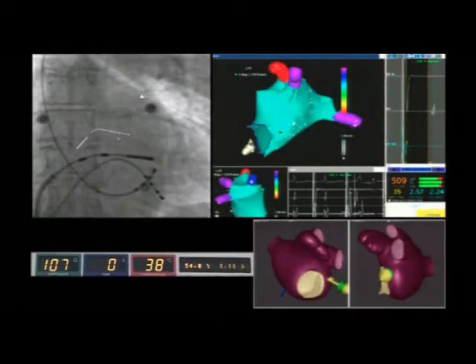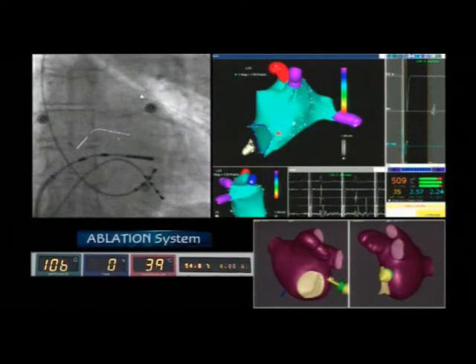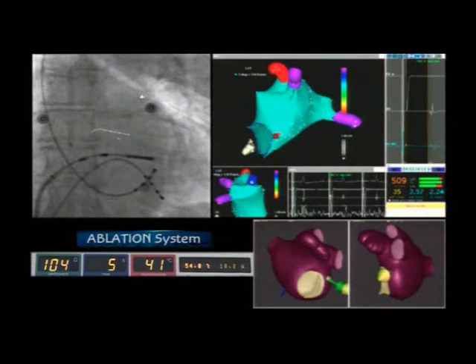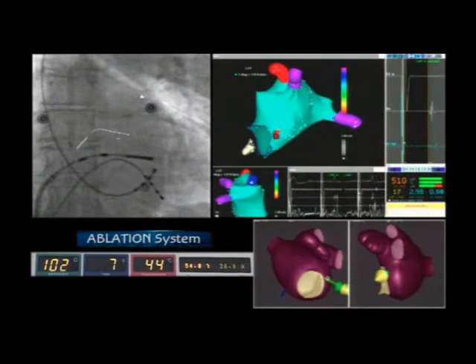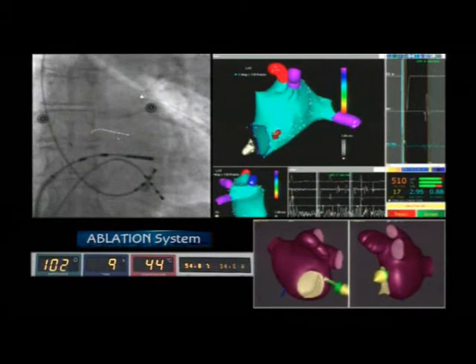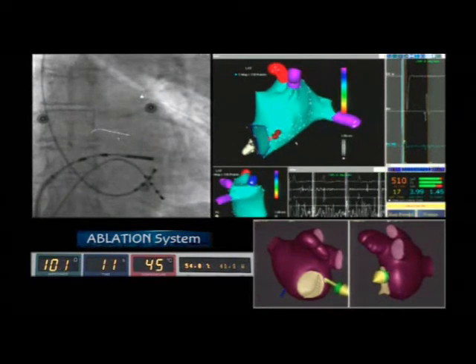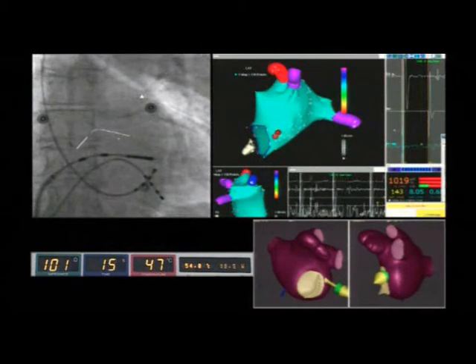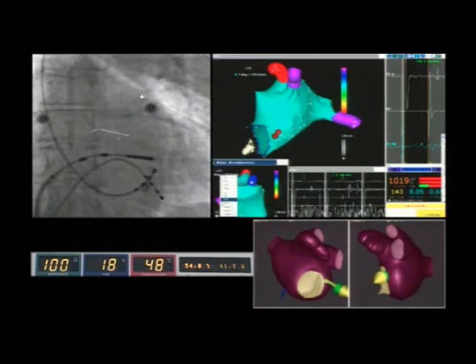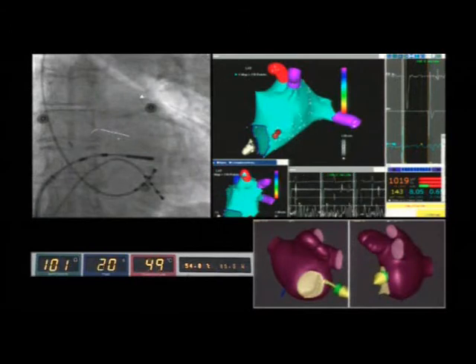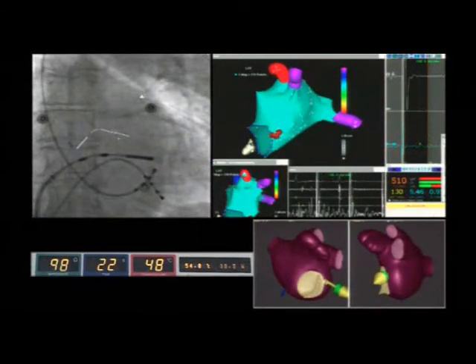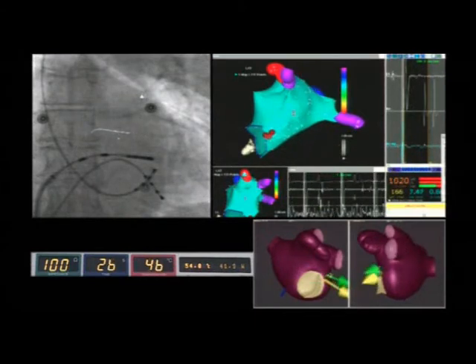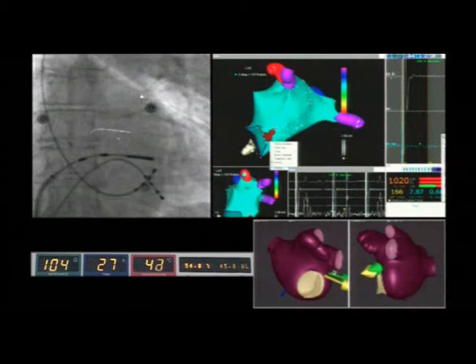The ablation procedure is entirely performed remotely by the operator, without the use of any automatic settings. The radiofrequency applications, shown with the red dots on the CARTO screen, are initially performed on the mitral isthmus according to our modified strategy. You can see a point-by-point radiofrequency application starting at the mitral annulus towards the left inferior pulmonary vein.